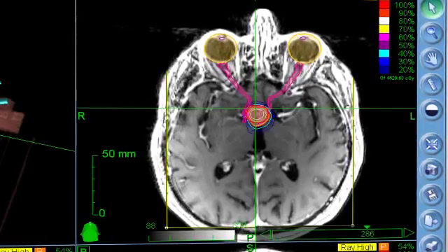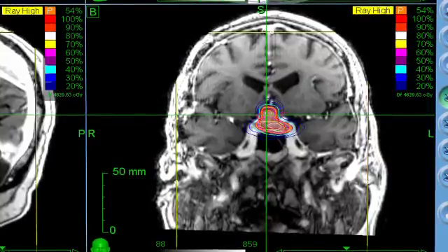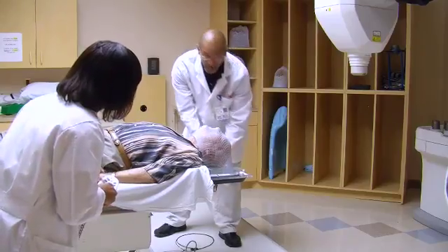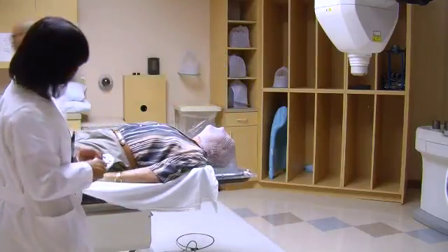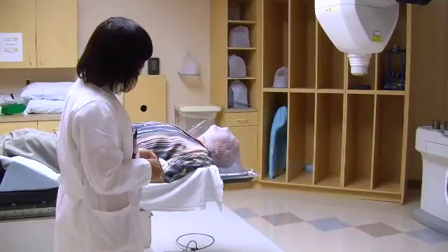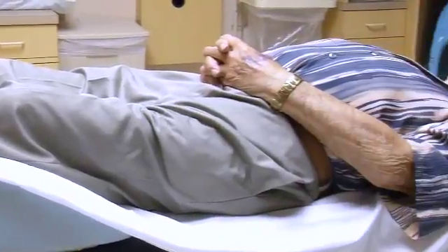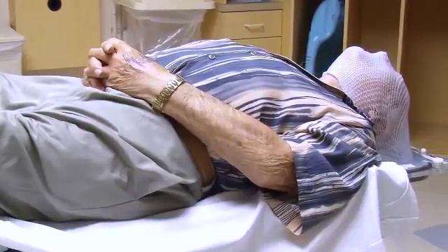It's that last 5% of the tumor that is particularly attached to the critical structures that holds most of the risk. With the CyberKnife, I can make the decision about not taking a risk surgically because I know that I have an alternative, effective, and safe treatment for that risky part of the tumor.